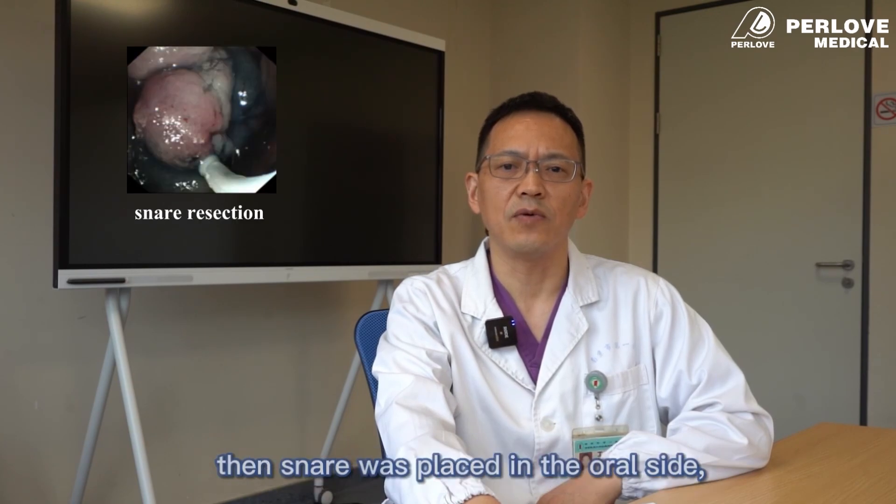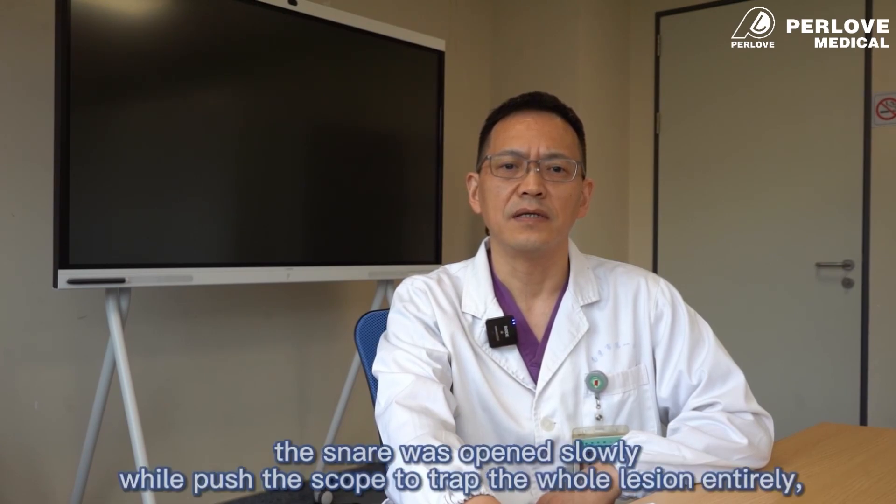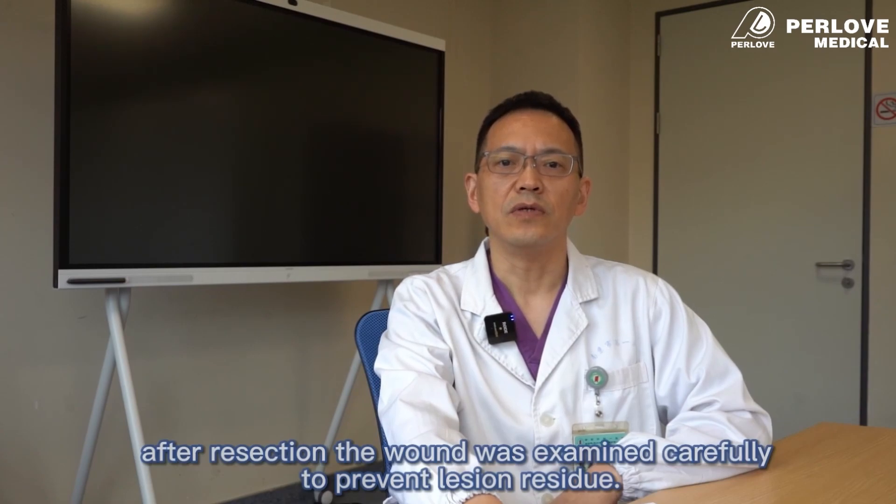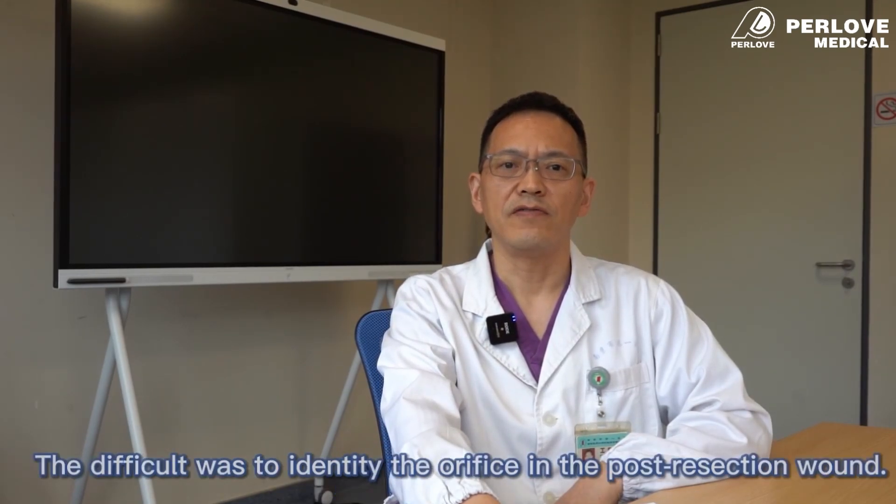Then the snare was placed on the other side, incising a hole with the snare tip. The snare was opened slightly while pushing the scope to trap the whole lesion entirely. After resection, the wound was examined carefully to prevent lesion residue. The difficulty was to identify the orifice in the post-resection wound.